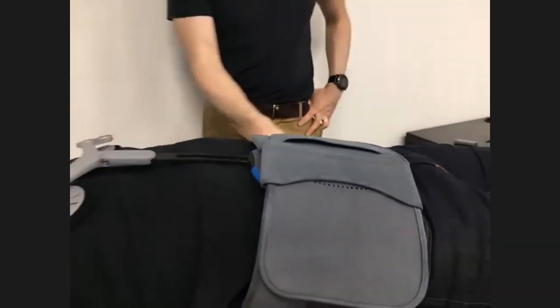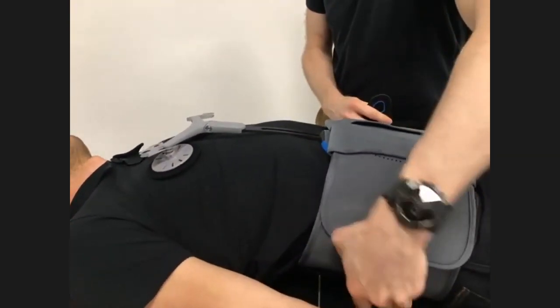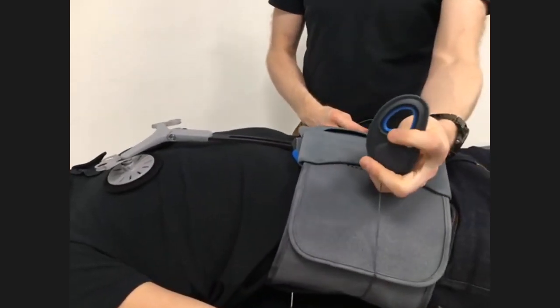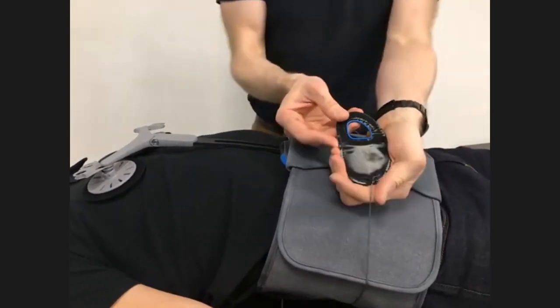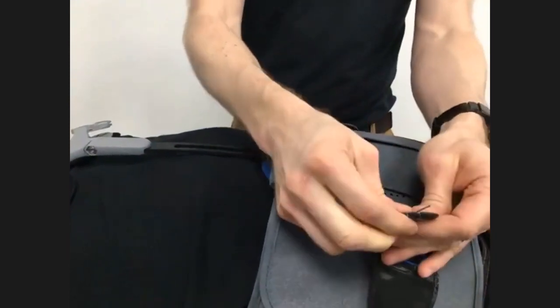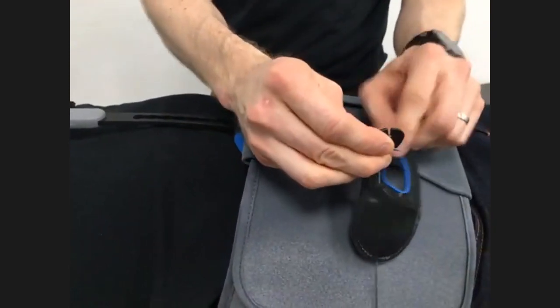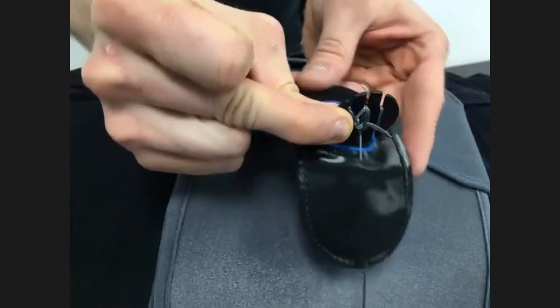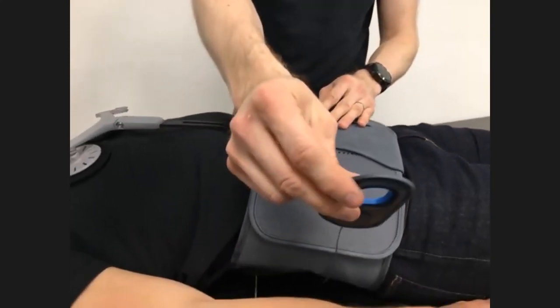Okay, before we go up to the shoulder straps, what we do is undo these two handles either side, and you can see that these are blue, which is for the patient to adjust. And then if I turn this over, you can see that there's a small pocket in here, and then you can adjust the length. In this case, I'm just going to make it a touch longer, but you can wind this round. It's difficult to see because my hand's in the way, but you can wind this round in order to adjust it and get it in the correct position. Once you're happy with that length, you can just adjust it.